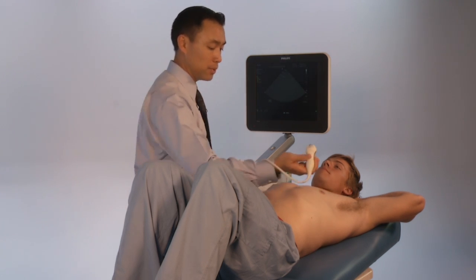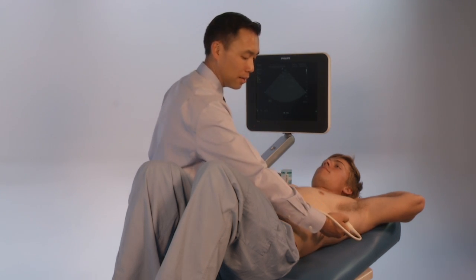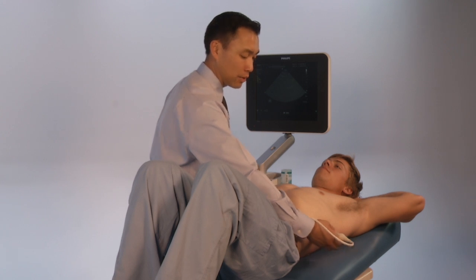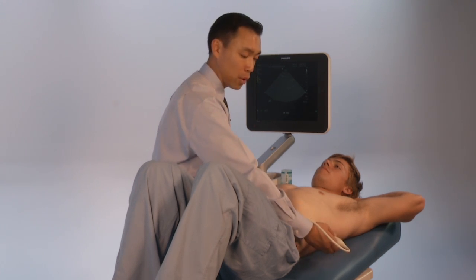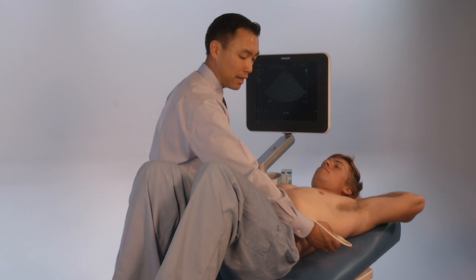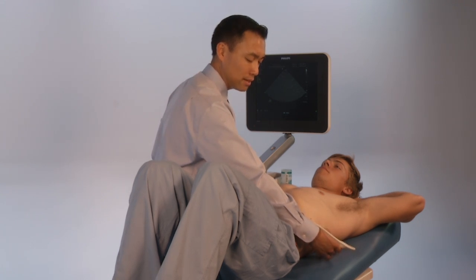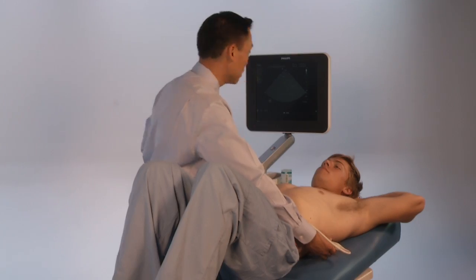Where you want to position the probe is the posterior axillary line — what they call knuckles to the bed — because the spleen is posterior. You're going to be around the seventh or eighth intercostal space.